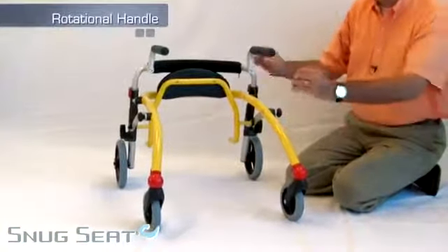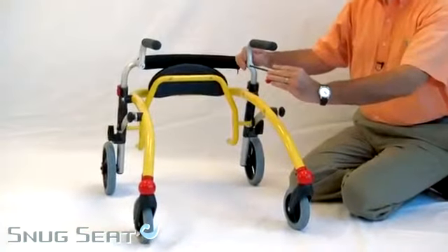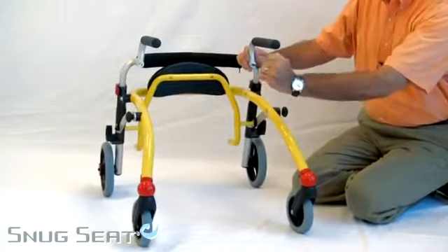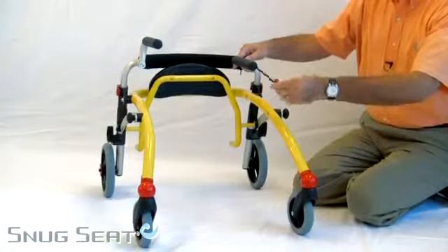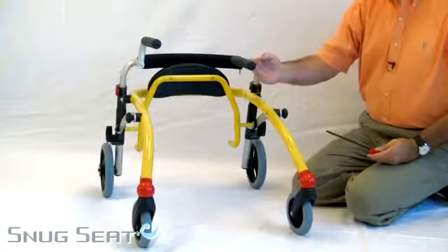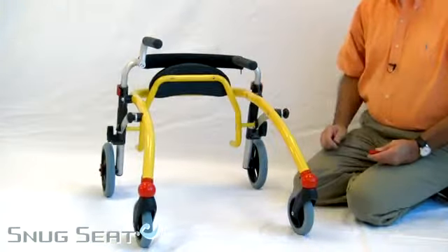One of the very nice features of the Crocodile is the rotational handle. It adjusts with a 6mm Allen wrench — you simply loosen the nut and rotate the handle. This allows for adjustment in width as well as height, and also better support for the child.